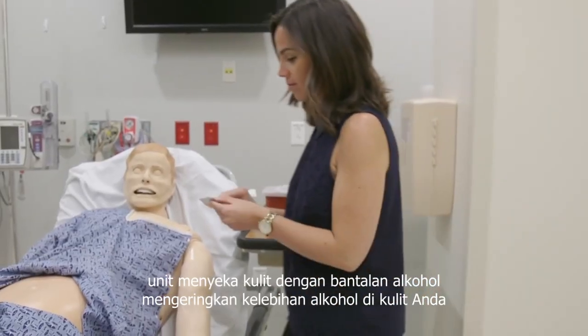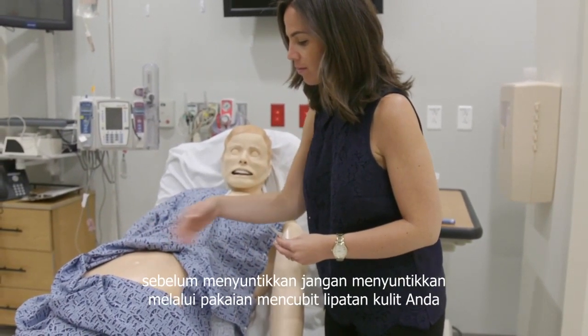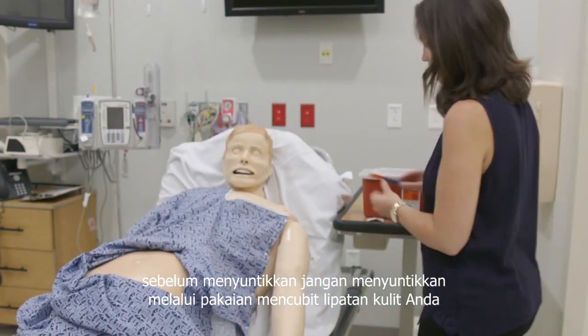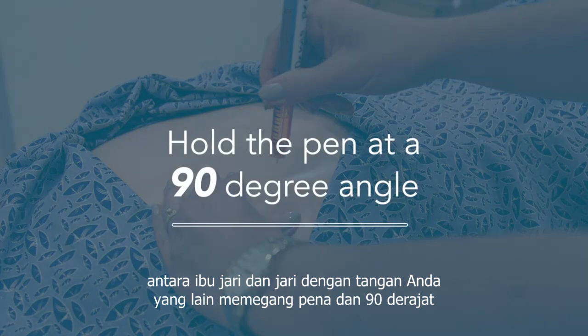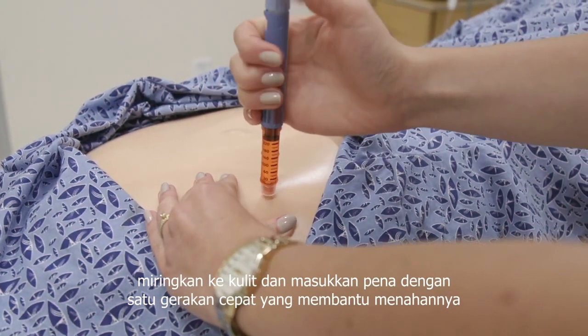Clean the skin with an alcohol pad. Dry off any excess alcohol on your skin before injecting. Do not inject through clothing. Pinch a fold of your skin between your thumb and finger. With your other hand, hold the pen at a 90-degree angle to the skin and insert the pen with one quick motion.